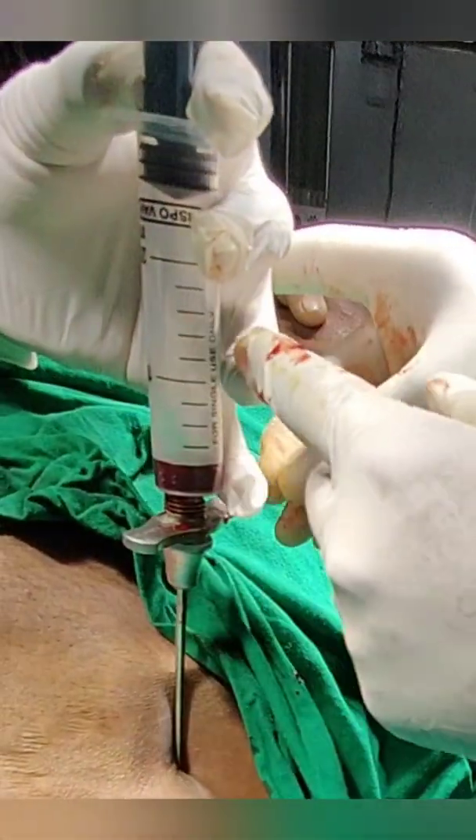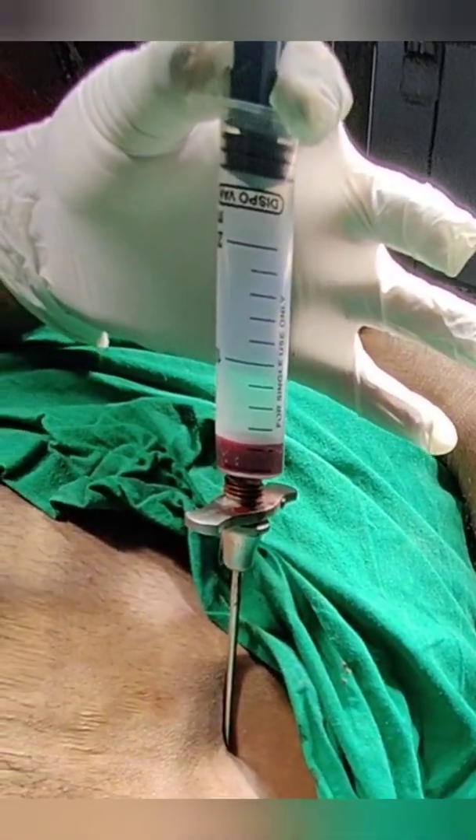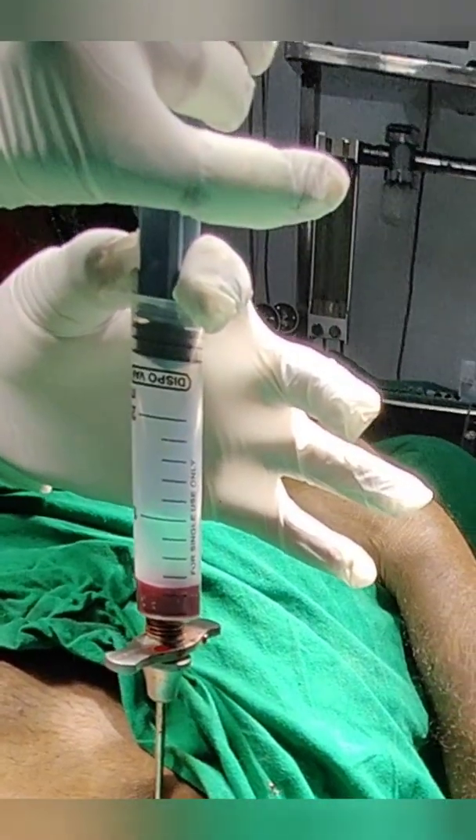Remember the direction of the Jamshedhi needle — it should be directed perpendicularly downwards and 2-3 degrees towards the medial side.